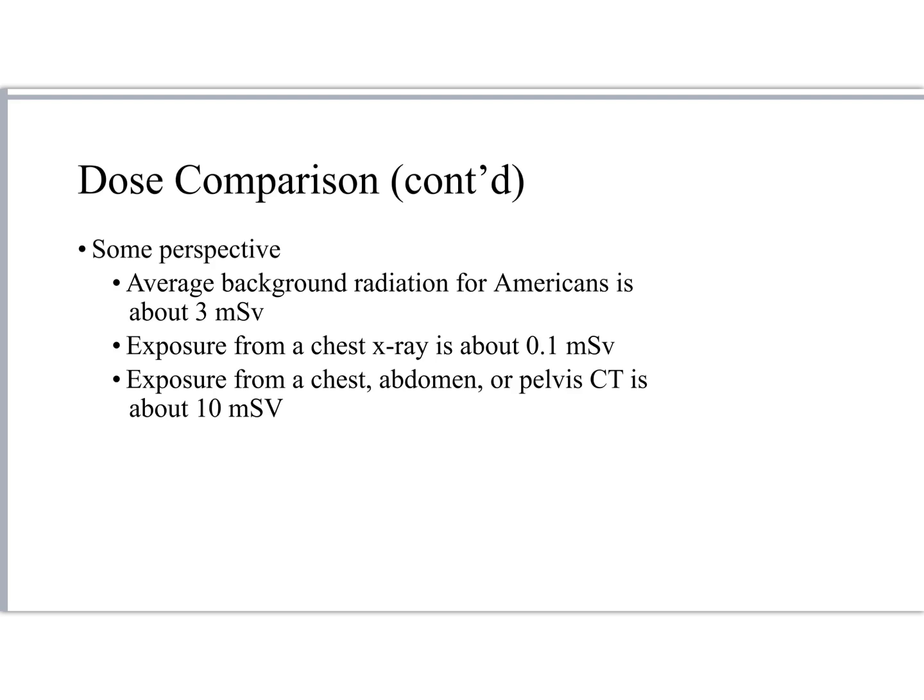We are well above natural background radiation when we walk into the CT department and we're doing those exams, right? So I'm emphasizing this because, again, there is that culture within CT to become kind of accustomed to the amount of radiation that we're using, when really we should not become accustomed to it, because it is significantly higher than natural background radiation. Versus within the X-ray department, I think we can ease off a little bit on freaking out about radiation exposure, because it is significantly lower than natural background radiation.